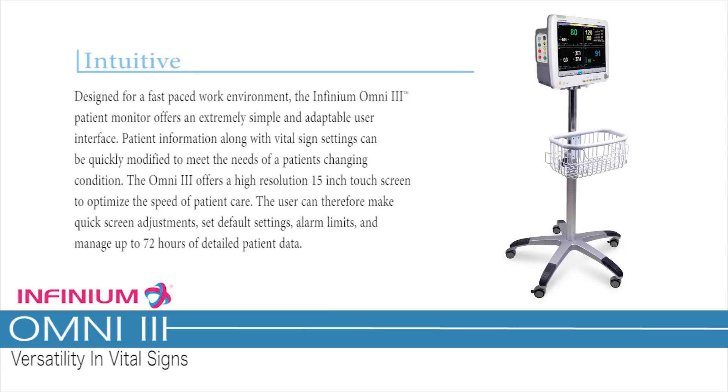Intuitive. Designed for a fast-paced work environment, the Infinium Omni 3 patient monitor offers an extremely simple and adaptable user interface. Patient information along with vital sign settings can be quickly modified to meet the needs of a patient's changing condition. The Omni 3 offers a high-resolution 15-inch touchscreen to optimize the speed of patient care.